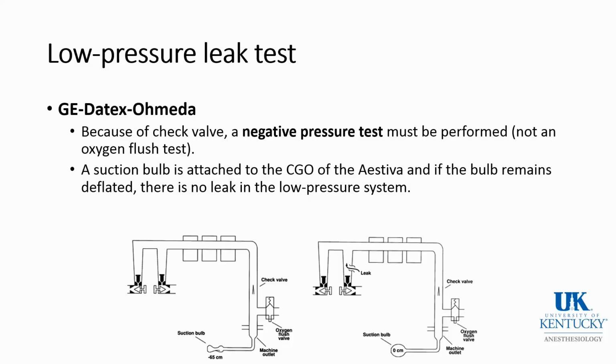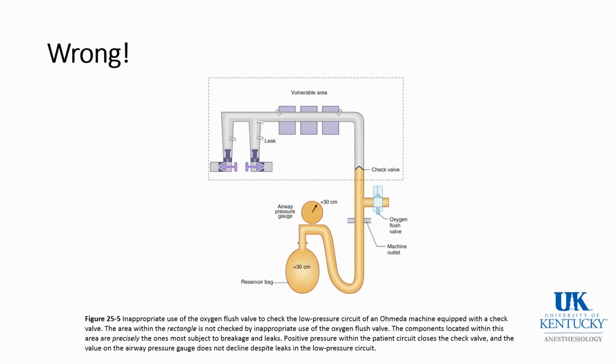Our department does not have a suction bulb in every machine. Some departments do. It's considered part of their daily check for an Aestiva or similar machine.